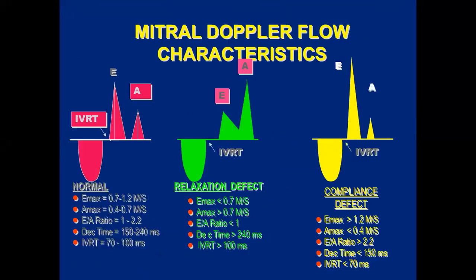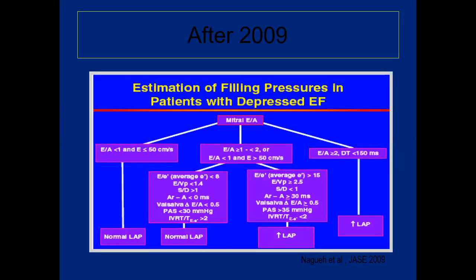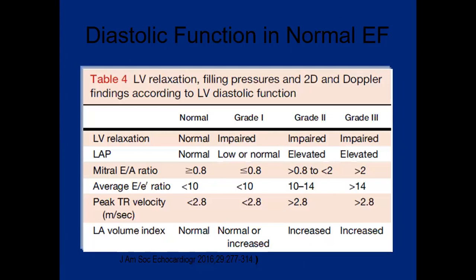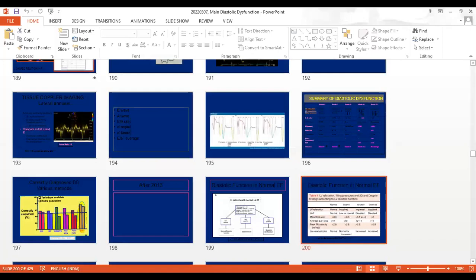But fortunately, I have these slides, that's why I could show you. Otherwise, we were not using this kind of pattern anymore. This is 2009, when we have newer guidelines, and this is 2014, when we have further change in the guidelines to take care of all subjects, in 2016, not 14, 16. But still many people do it. And I find this method, what you asked me, is a very effective method for talking of diastolic function abnormalities. Nothing wrong about it. It's fine if you're doing this kind of practice.